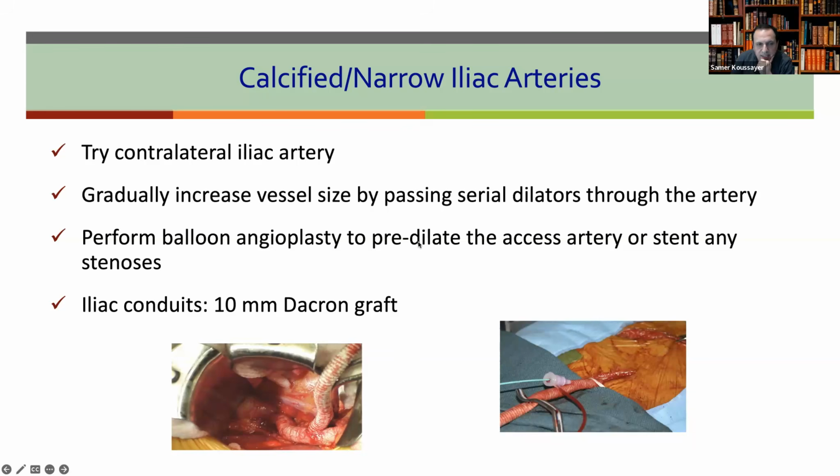The most important thing, guys: if you have an iliac stenosis and you balloon it, and even if you see a dissection, don't stent it now.